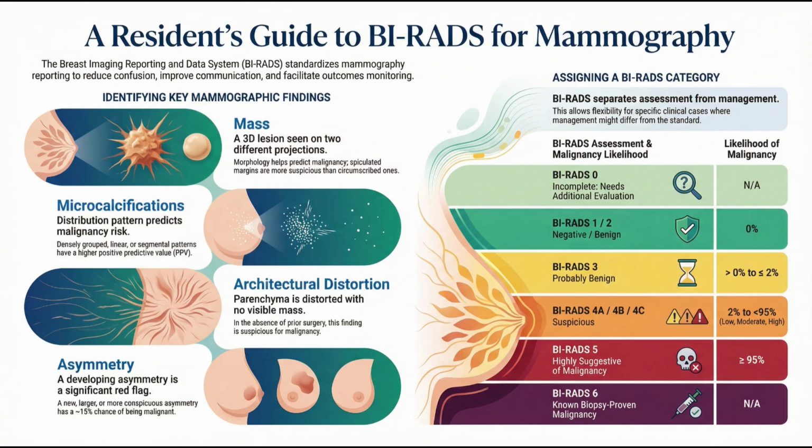Okay, now what about a finding that sounds innocent but actually pushes things towards suspicion? That would be a solitary dilated duct. It's a rare finding on a mammogram, but it's important because it can be associated with non-calcified ductal carcinoma in situ, or DCIS. And just to remind our listener, DCIS is? DCIS is ductal carcinoma in situ. It means you have cancerous cells, but they're still contained inside the duct. They haven't invaded the surrounding tissue yet.